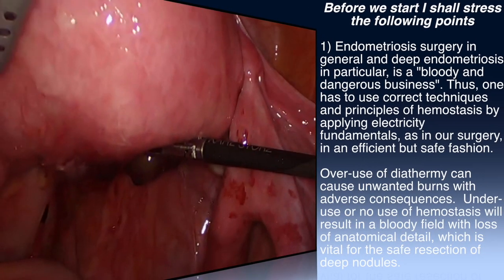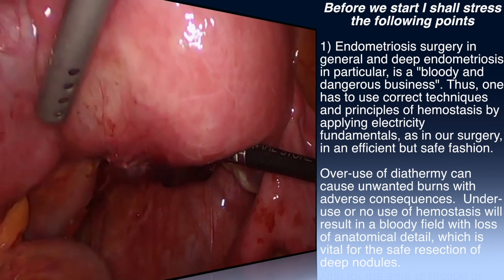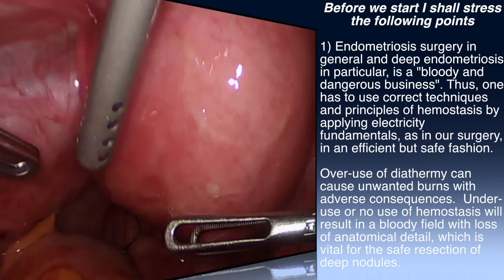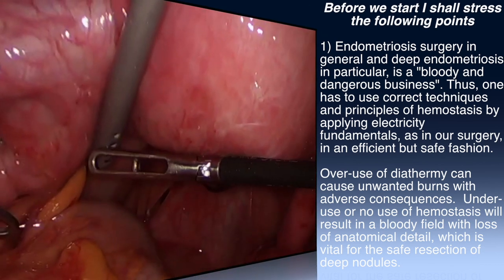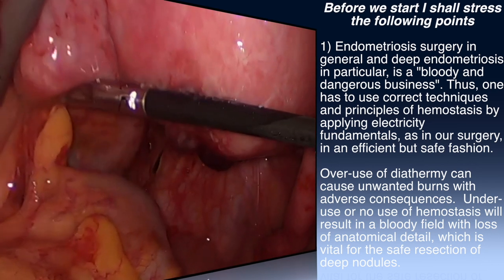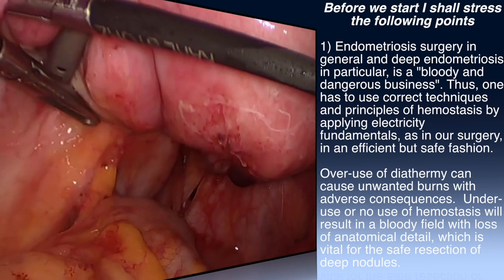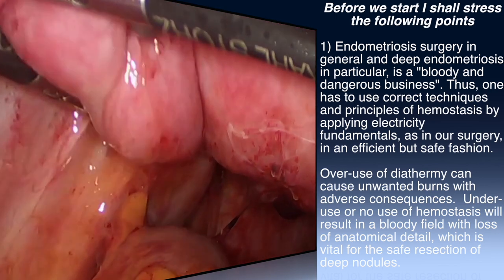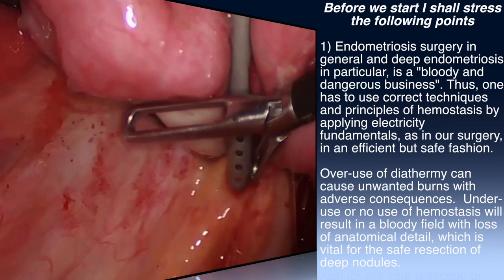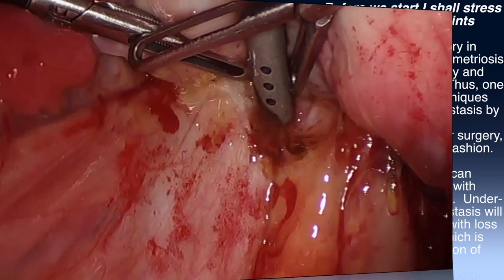Before we start, I shall stress the following points. Endometriosis surgery in general, and deep endometriosis in particular, is a bloody and dangerous business. Thus, one has to use correct techniques and principles of hemostasis by applying electricity fundamentals in an efficient but safe fashion. Overuse of diathermy can cause unwanted burns with adverse consequences. Underuse or no use of hemostasis will result in a bloody field with loss of anatomical detail, which is vital for the safe resection of deep nodules.